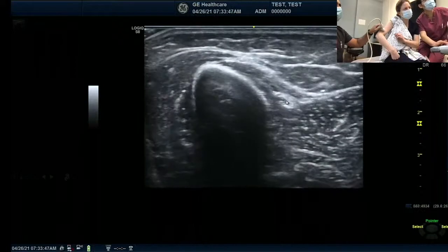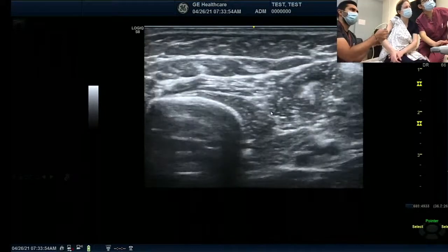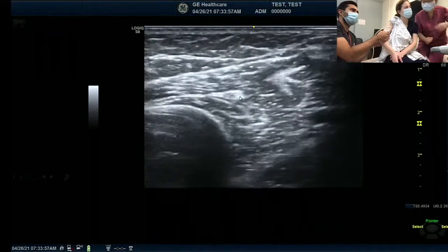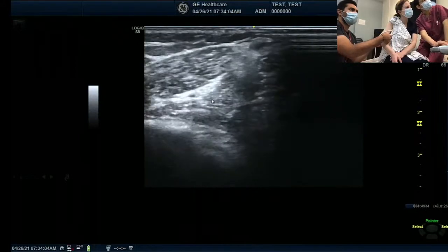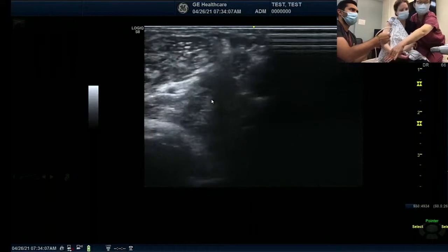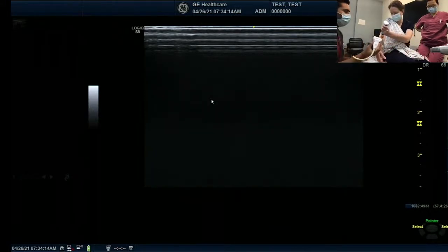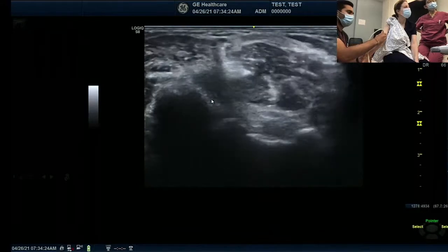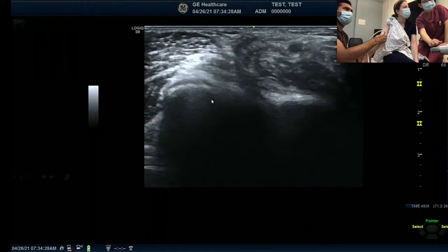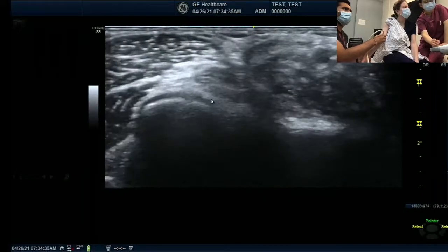He moved his transducer. It's in the brachialis and brachioradialis start from here. Now he's going to move his transducer distally to the elbow joint. Let's go to our home base. And then now you're going to do supinate. Okay, show me the trochlea and capitulum. Perfect. So now Divas is able to come to the elbow joint, our home base.